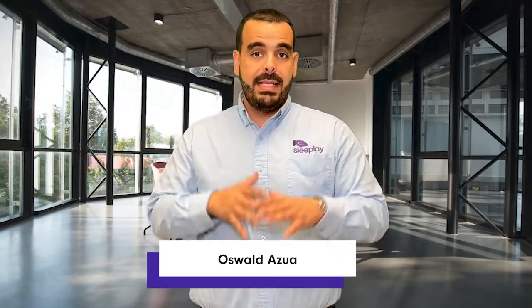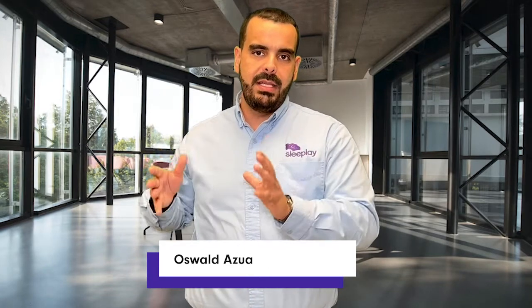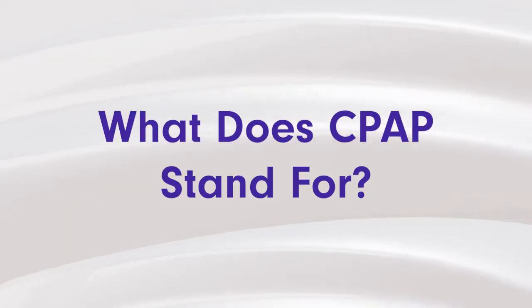Today we're going to be talking about CPAP. What is a CPAP and how does it work? CPAP stands for Continuous Positive Airway Pressure. Now let's break that down. The continuous, it's providing a constant pressure, nonstop. The PAP is positive airway pressure, that's a positive pressure that's being introduced into the body.